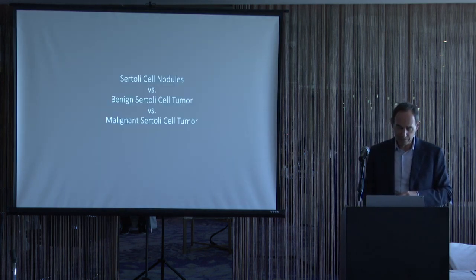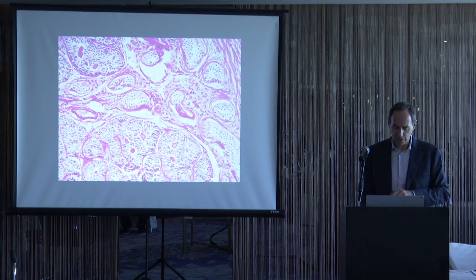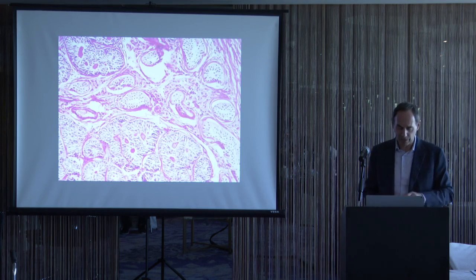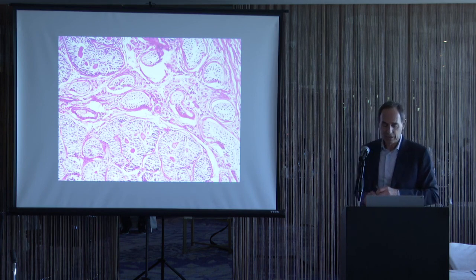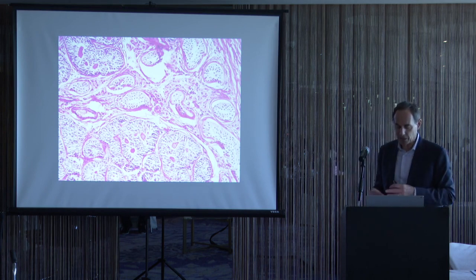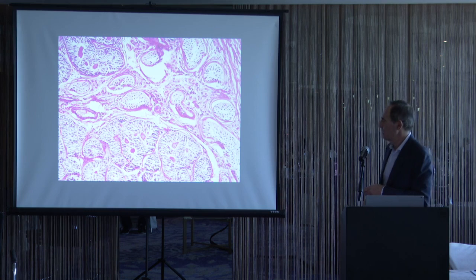And with that, we'll deal with Sertoli cell nodules. We can deal with it now briefly. So it's not uncommon in testes to see Sertoli cell nodules. Often in cryptorchid testes, these are not tumors, they're more hyperplastic, and they can have two different morphologies. One are these seminiferous tubules. They look like seminiferous tubules lined by these columnar cells, but they have these very dense pink secretions in them, often almost forming little cribriform structures.